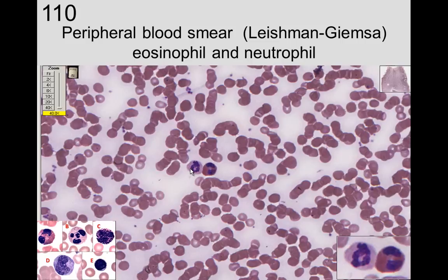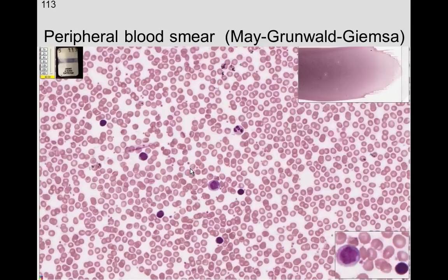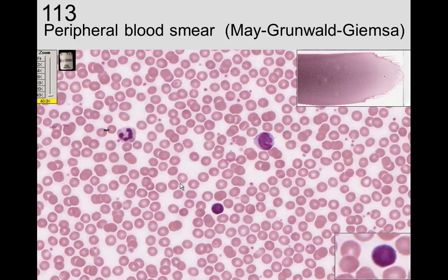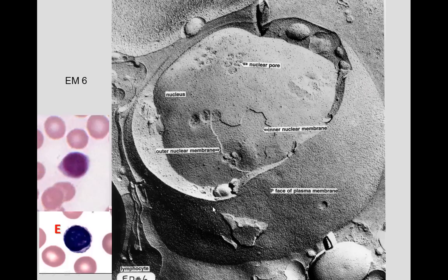We see the basophil with granules that are hard to see clearly. Two cells with lobulated nuclei are identified as an eosinophil and a neutrophil. On slide 113, we see another monocyte, multiple lymphocytes, a neutrophil, and small platelets. We also see a nice monocyte, red blood cells, and platelets as smaller formed elements.